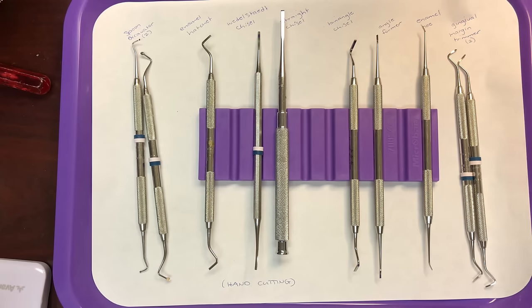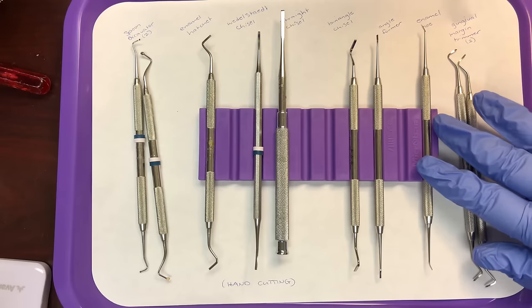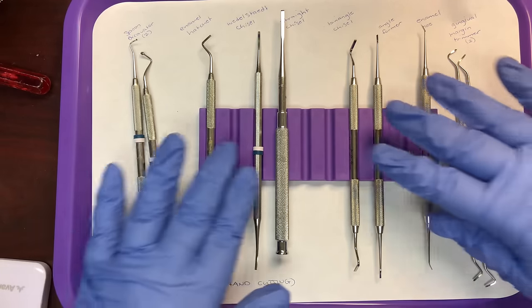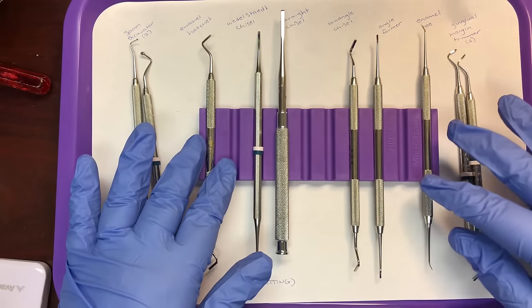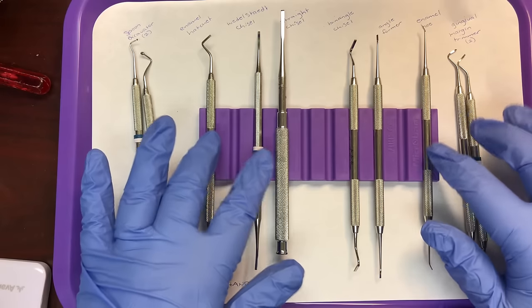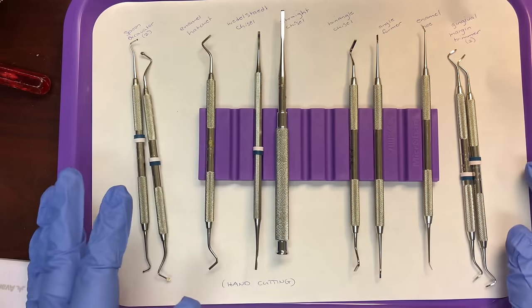In all honesty, a lot of doctors won't use hardly any of the hand cutting instruments. All of them will have the spoon excavators, but most doctors won't have all of these — they may always like to clean things up with an angle former, but most offices and doctors prefer using hand pieces instead of cutting the tooth by hand. The next category is restorative instruments.